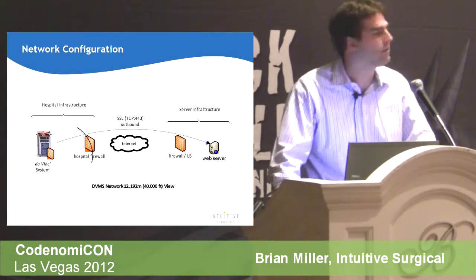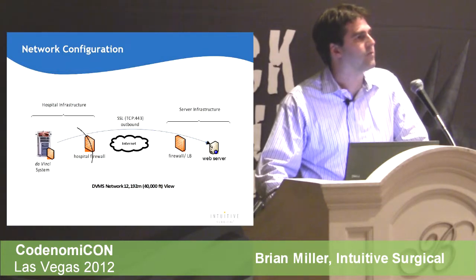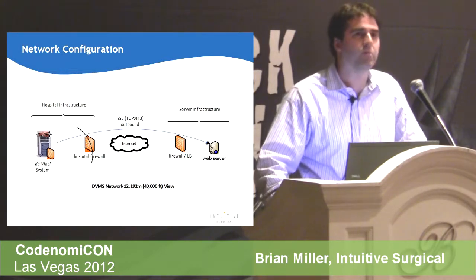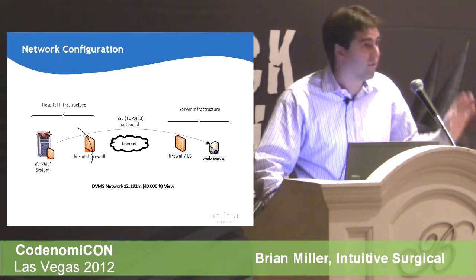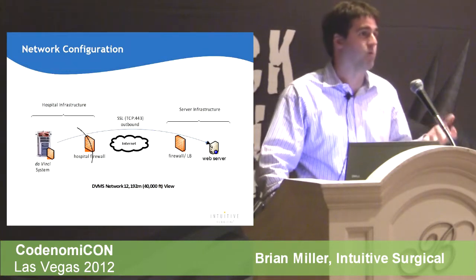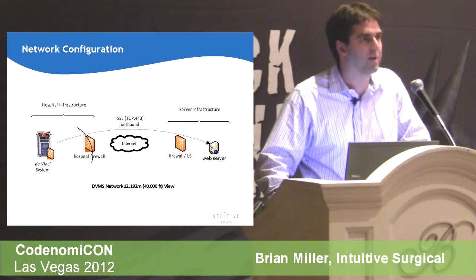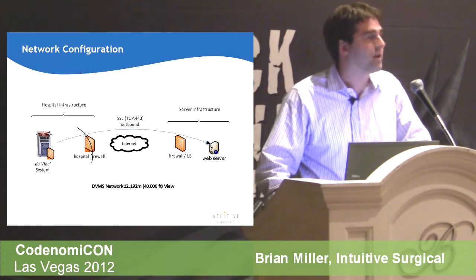And then the system would just stop communicating. One thing that I forgot to mention was that in our systems we've got our embedded implementation, and since we have real-time requirements, we try to minimize the footprint of the majority of the software modules. So with this, a lot of the parsers and whatnot are very small footprints, and so they're not the full-blown implementation. And we found that as we've started using these tools, we've been able to learn exactly what they're good at and what things they're not able to handle very well.